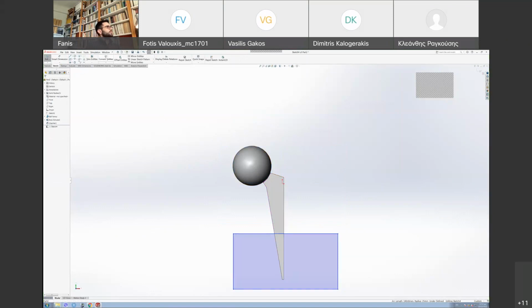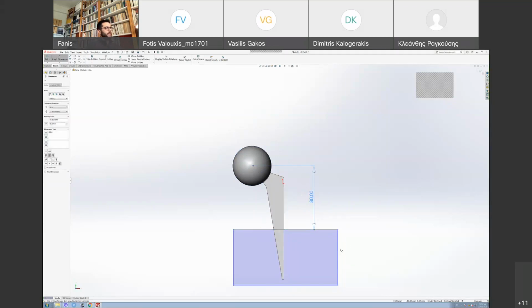So I will just convert this entity so I can work with it easier. Now I have the center of the sphere and I can say that I need this to be 80 millimeters. And you can add also some dimensions here. Again, they're not critical. It's just to have a defined sketch and not have things floating around in your design. Okay.